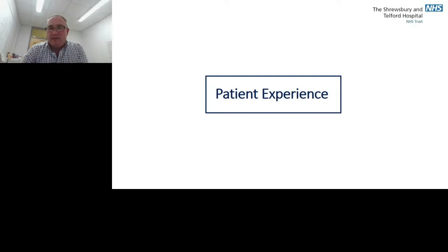So you can see it's a well-tolerated procedure. We do the vast majority of our NovaSures under local anaesthetic. From the trust perspective, we don't have to have inpatient beds. From the patient's perspective, it's been demonstrated to be safer. And there's publications that have confirmed that patients who have procedures under ambulatory care compared to general anaesthetic have less hospital-acquired infections, less VTE, and less complications. We do offer them under a general anaesthetic if the patient requests that.